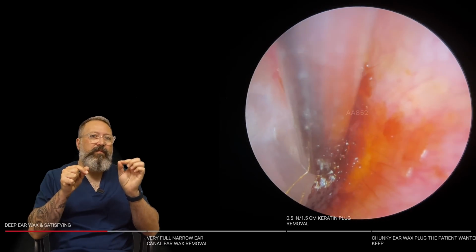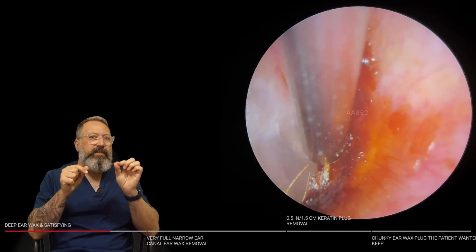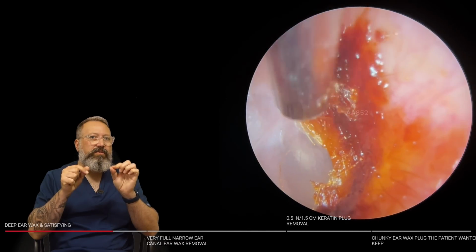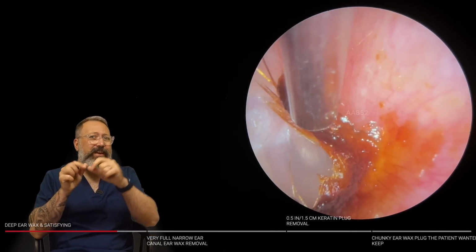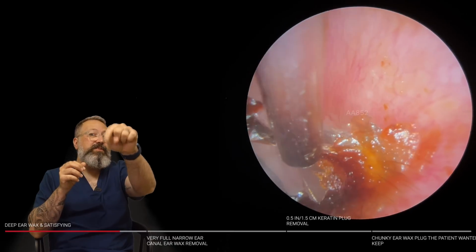So what we're left with here is a very thin, hard layer on the outer part of the ear canal. So we're just going to use the fine end here just to start lifting and start to peel this away. So I'm just working along the edge, but watch this as it peels. Difficult one to do because you don't want to work too close to your canal wall, but look at this coming away. All the way along the canal. It actually goes down into the anterior recess. You just see down there.